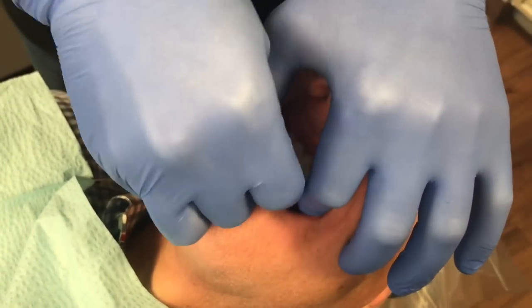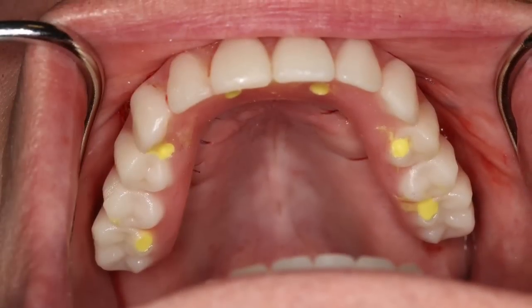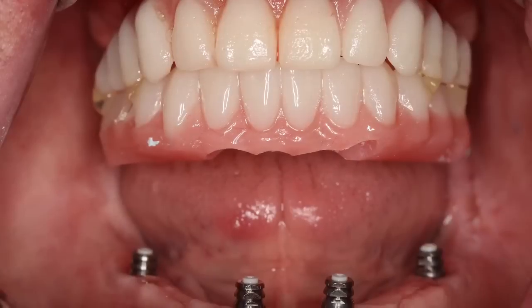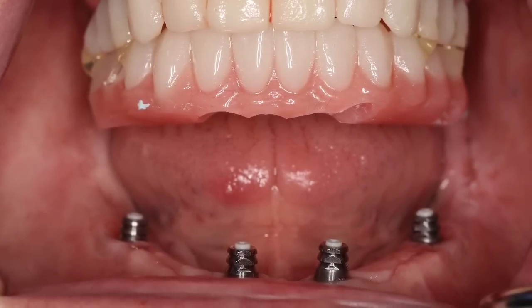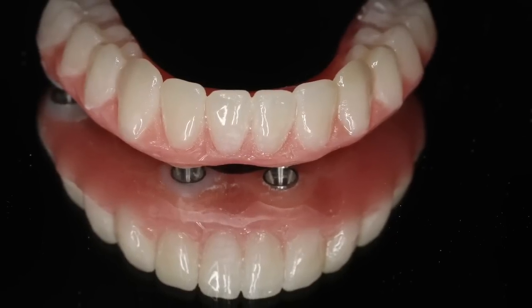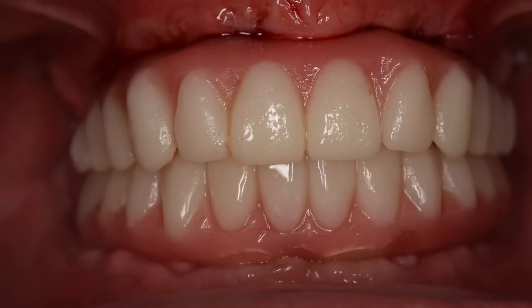Now we're going to just screw the prosthesis down and plug it up with whatever material you prefer — I use PVS. Then you bond the lower prosthesis in the ideal occlusion, rotate the patient into the lower prosthesis, and then repeat those same laboratory procedures in preparation for delivery to the patient.